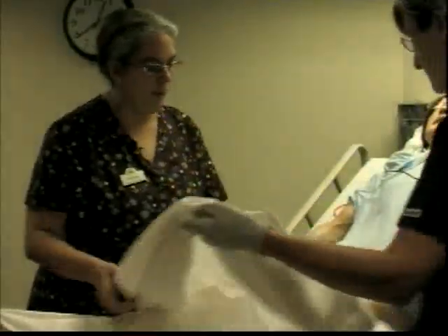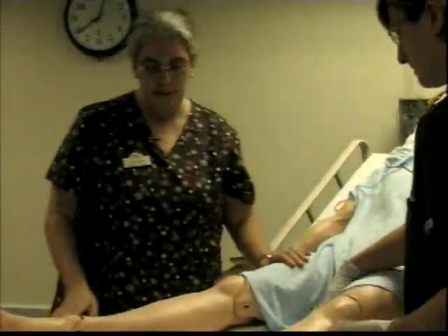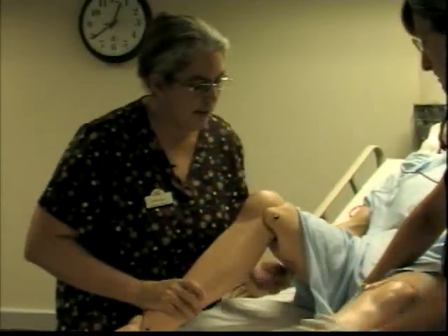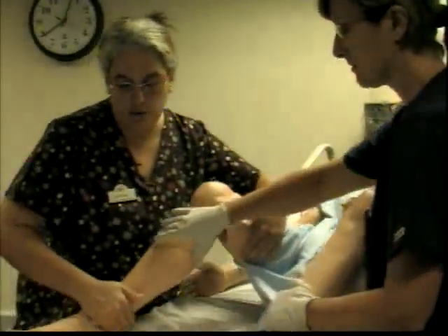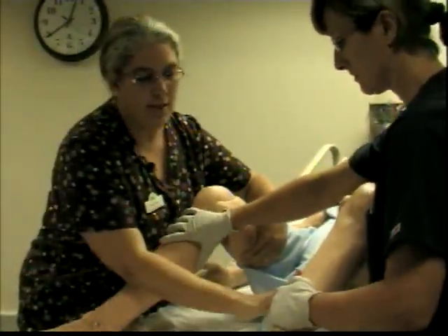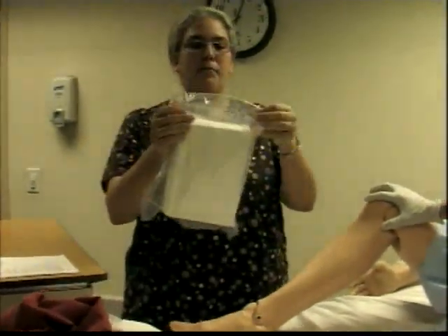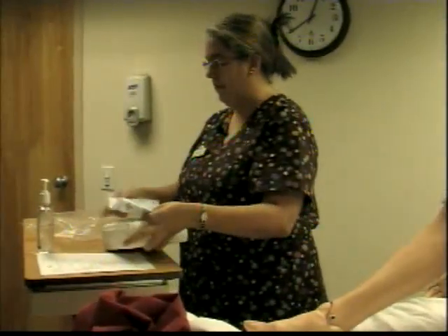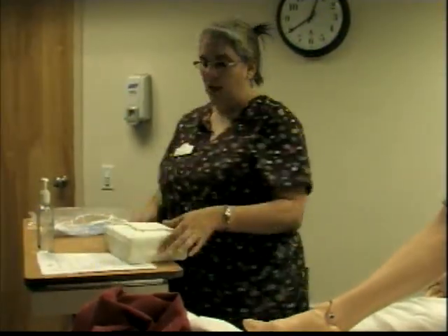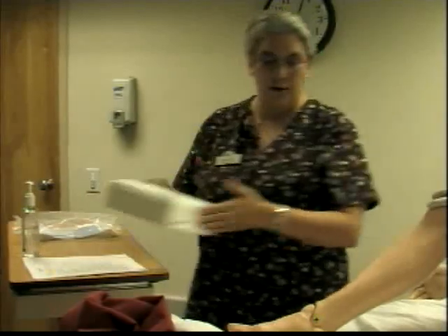I'm going to make sure I provide and keep privacy for my client. I'll roll the covers all the way down, bend her legs to expose the area, but keep her covered until I absolutely have to open it. Make sure it's nicely open, my assistant will help, and I'll prepare my kit. There's an opening into the kit — take it out, get the trash, and position your kit right next to the patient. You want to be very close to your patient.